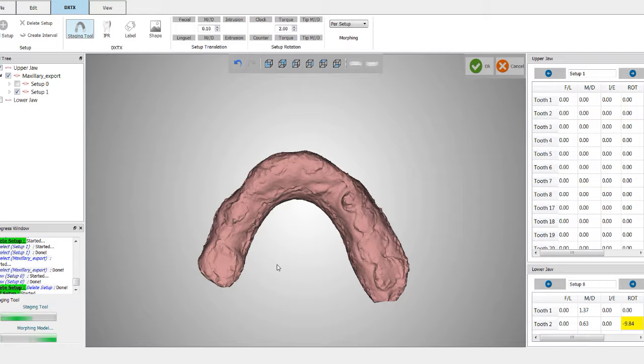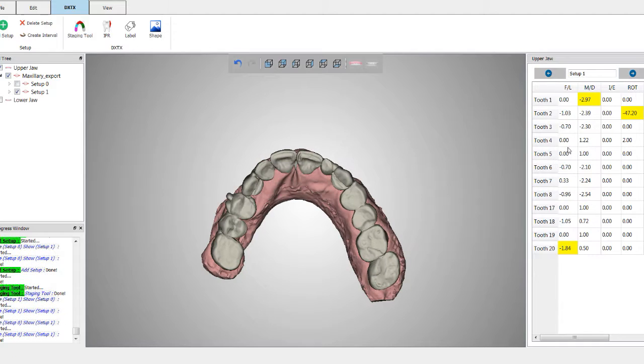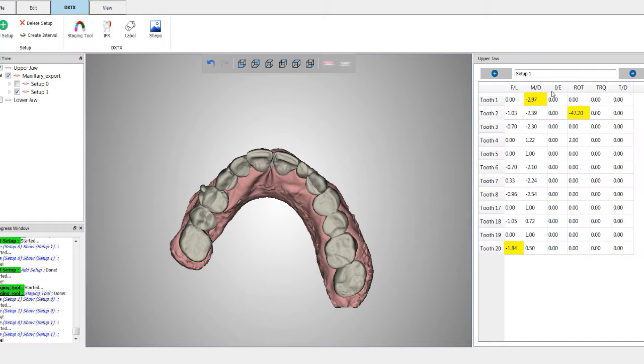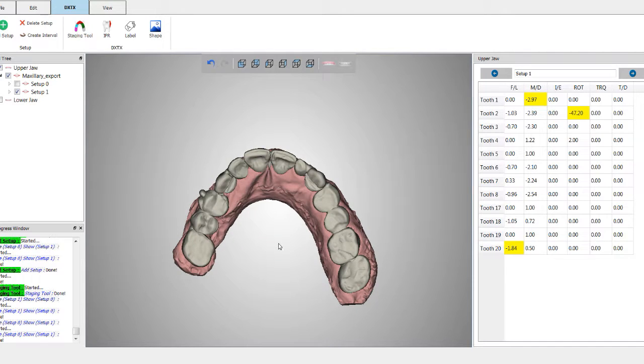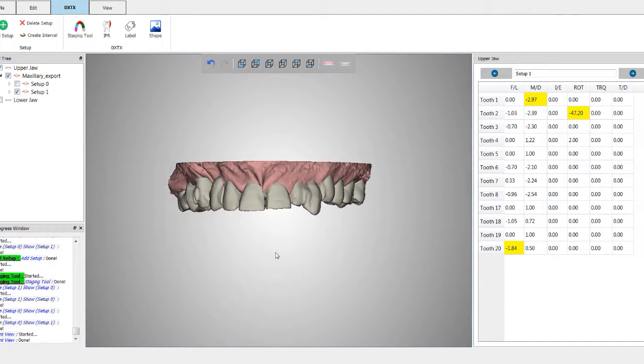Okay, so now we are simply calculating the tooth movements, or the distances that we built in with that setup, and so here are those distances, and just following our guidelines. We've got a lot of rotation to that bicuspid there, so I would actually break this up into 25 setups or 25 intervals. Actually, before I do that, I would look at these anterior teeth here to see if I would change anything. And let me point out one thing.